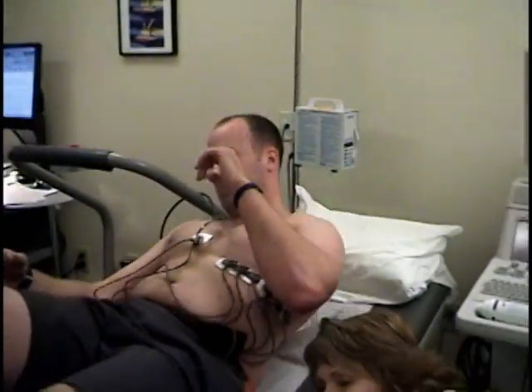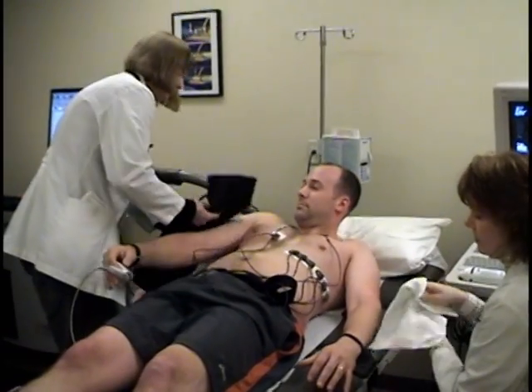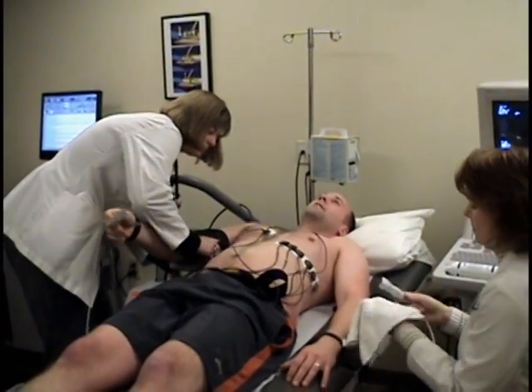Once the test is complete, you will be observed for at least 8 minutes or until your blood pressure and vitals are back to normal.